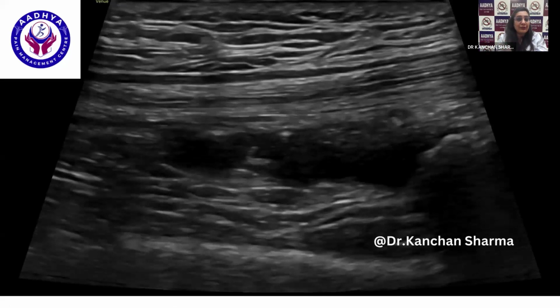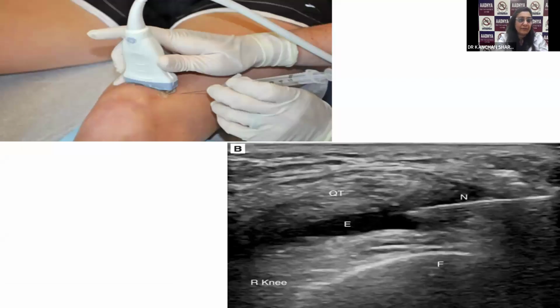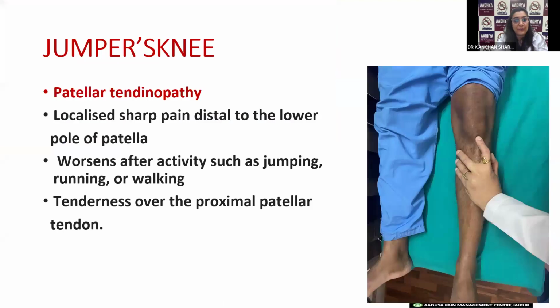Because if you look at the recent articles about osteoarthritis, they do say that in these individuals also you can get some amount of synovitis, and that will be the reason for this fluid, even in the osteoarthritis individual. So if it is a simple fluid, you are not able to see anything, right? It is compressible, displaceable, no color Doppler activity, then you can be a little bit confident that you are not dealing with a patient of inflammatory arthropathy. Then if you want to give the intervention, this I have already taught you.